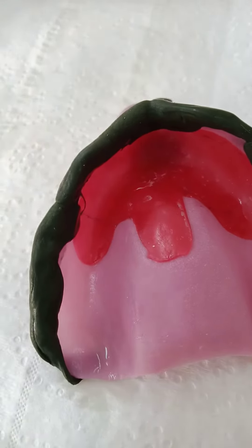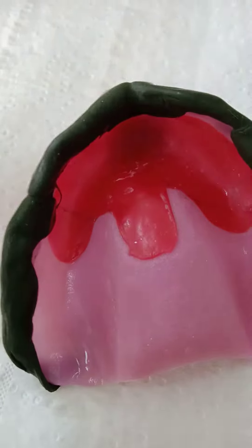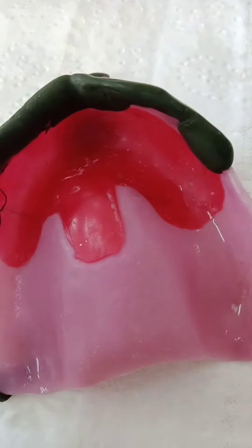The fifth reason: when you don't seat this area on this side, while you're doing the other side this is not seated. While you do the other side, you will have rocking in the tray. So try to remove it whenever it happens — don't wait until the end of the border molding.